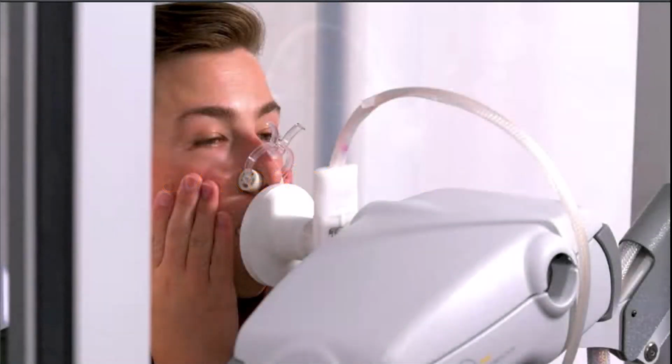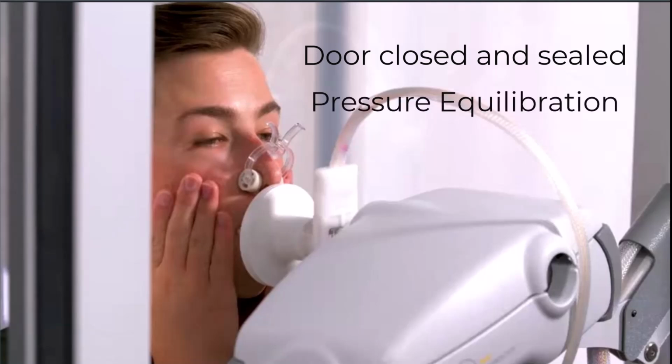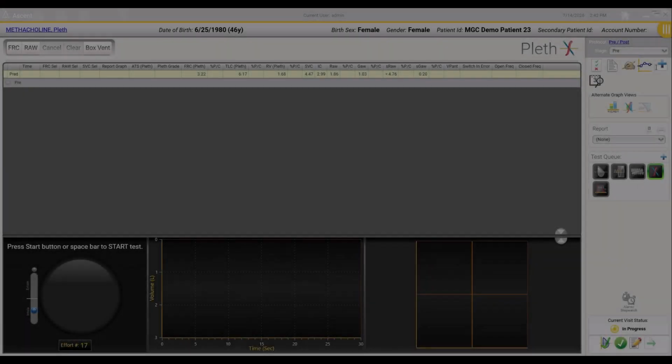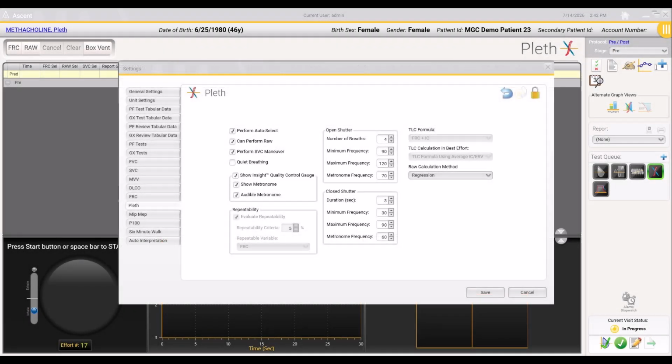The same basic principles that applied to FRC testing are also true for airway resistance efforts. The box door must be closed and sealed, pressure inside the cabin must stabilize, and the patient uses nose clips and places their hands on their cheeks. Press the F5 key on the keyboard to verify the panting frequencies for open shutter breathing.